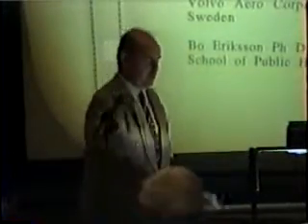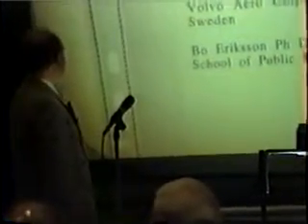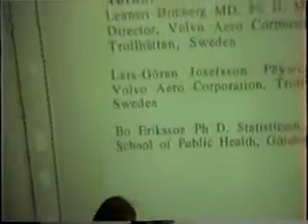Yes, I'm going to tell you a little bit about the study of inversion therapy that we've done at our plant. The other authors, besides myself, are Lars-Göran Josefsson, the physiotherapist, and the statistician Bo Eriksson, who have been involved in this particular study. Now, inversion therapy has been known since the days of Hippocrates. He used a special arrangement where the patient was hung upside down with his feet tied to the rungs of a ladder. By ropes over a pulley, the ladder was hoisted vertically and dropped, imparting an abrupt tractive force to the spine. So let me have the first picture, please.